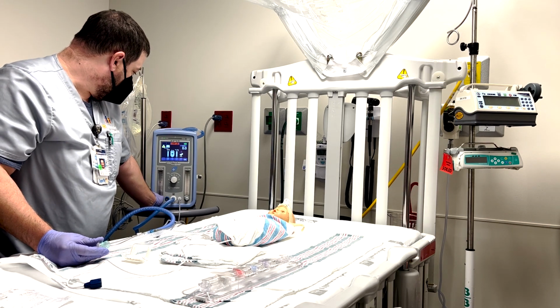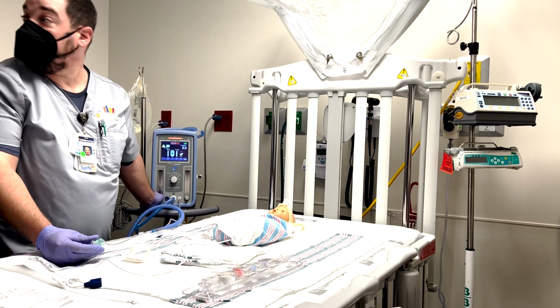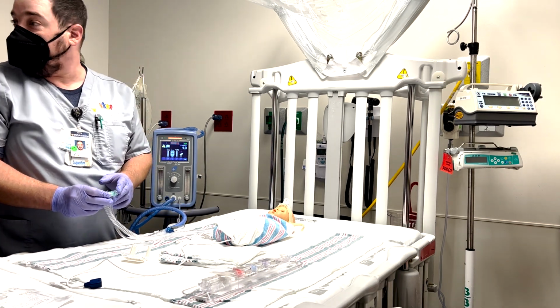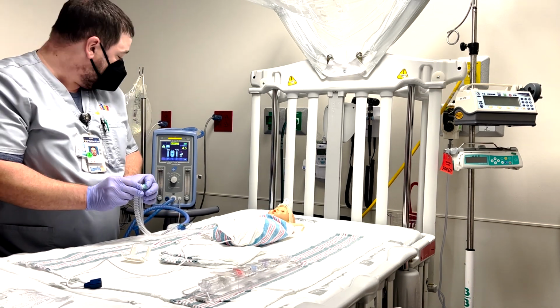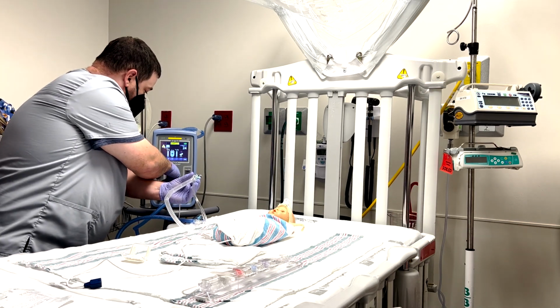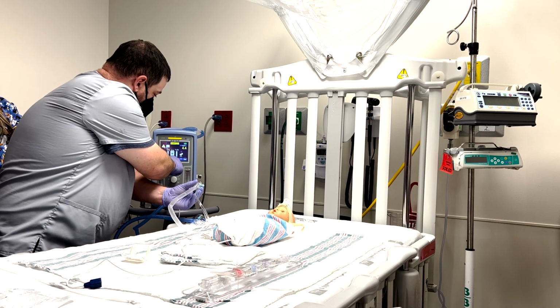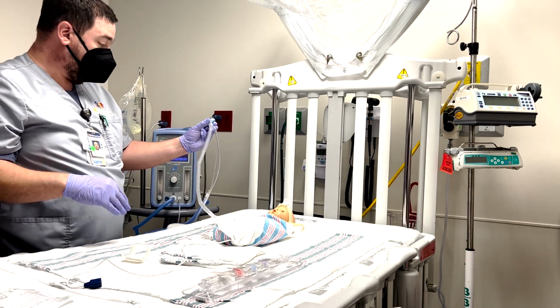That noise all the time sounds like when my boss yells at me. So what you have to do is occlude it, so that it gets that pressure. We pick whatever oxygen we want to be on. Let's see, it's giving us a PEEP of 4.4.